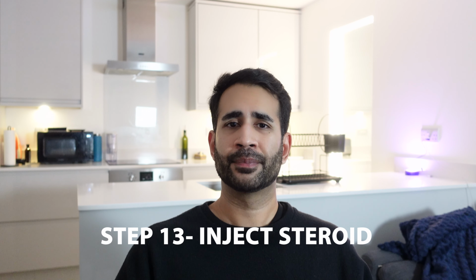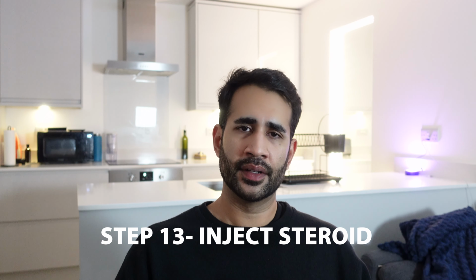Then once the needle's been confirmed to be in the right spot and they're happy with the way that the contrast or air is filling the space, then they'll inject the medication. And again, there is usually a bit of local anesthetic and a bit of a steroid, that's usually the combination of medications that are injected. Again, it might cause some of the symptoms to reproduce themselves the same way as the contrast or air injection might do. But again, it's quite quick, and then the local anesthetic in the injection usually kicks in quite quickly, and you usually will feel quite comfortable quite quickly.